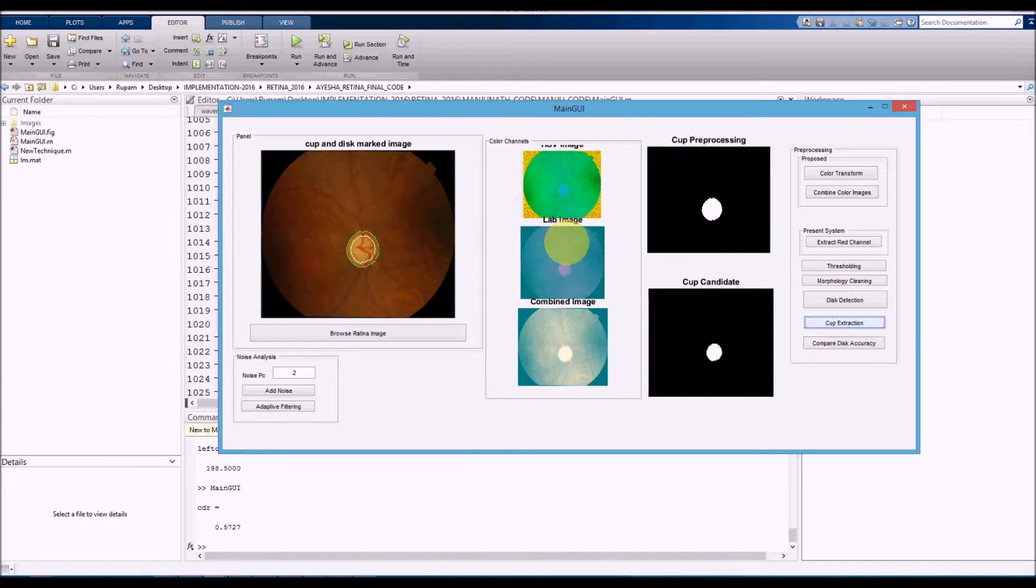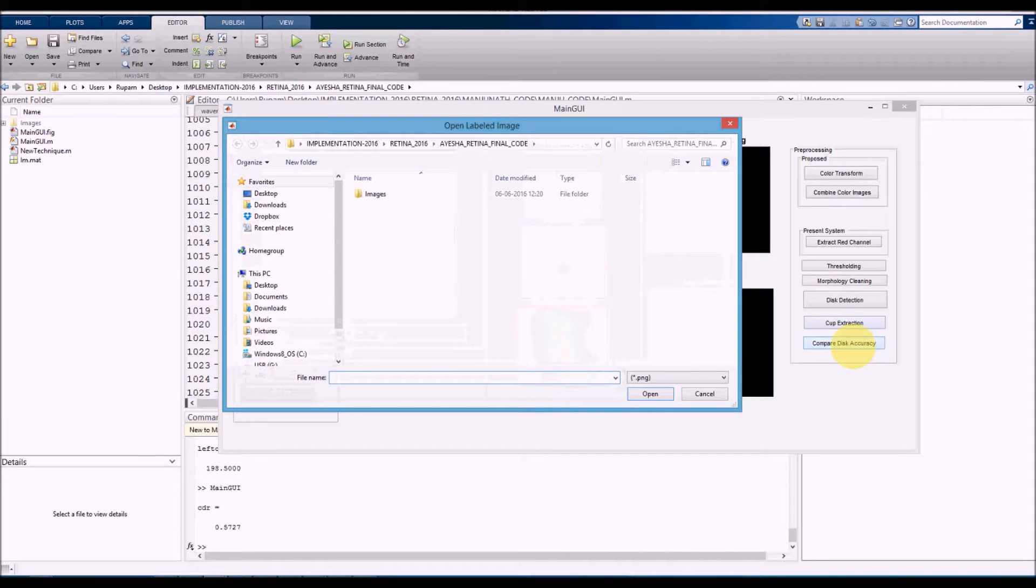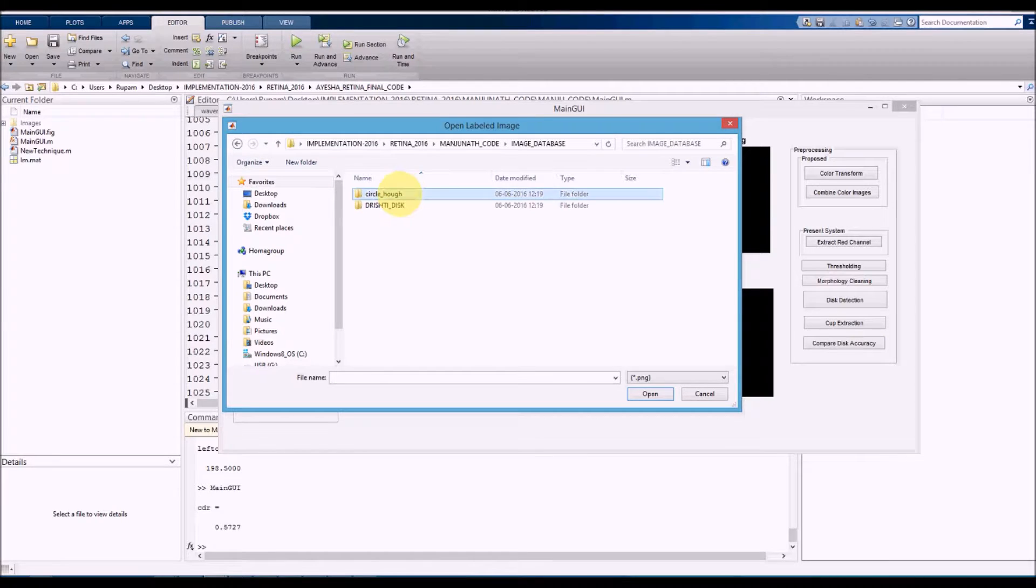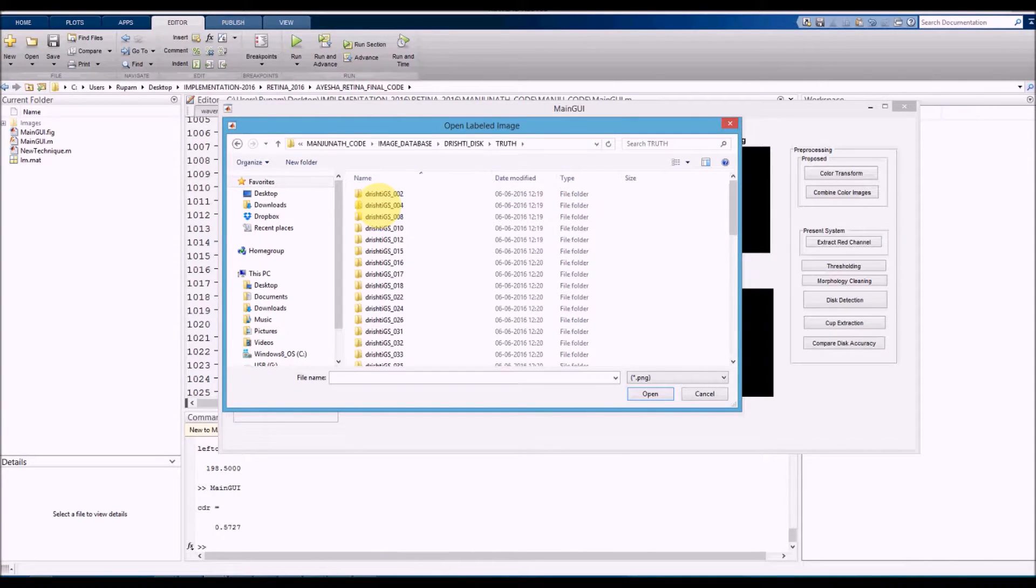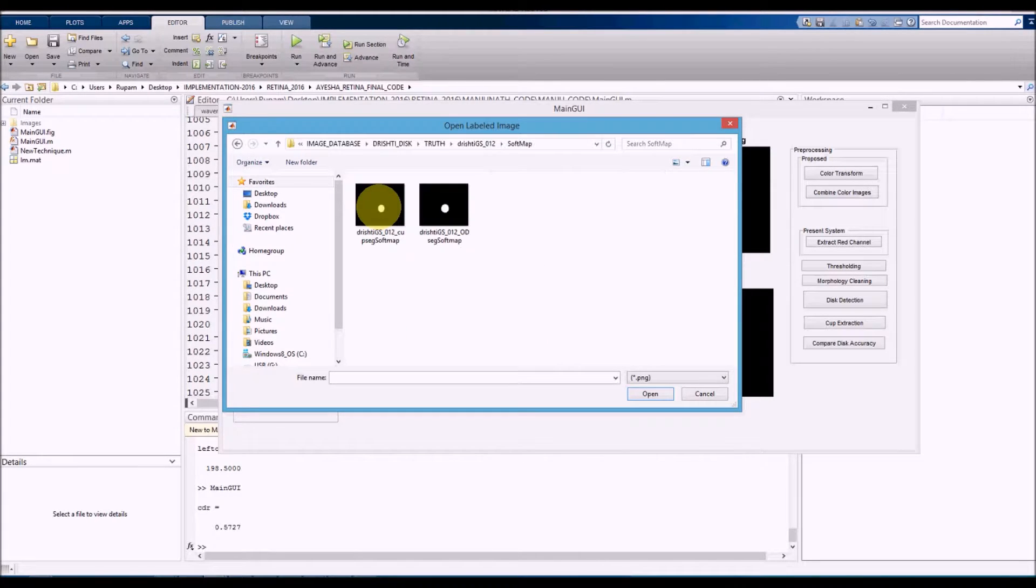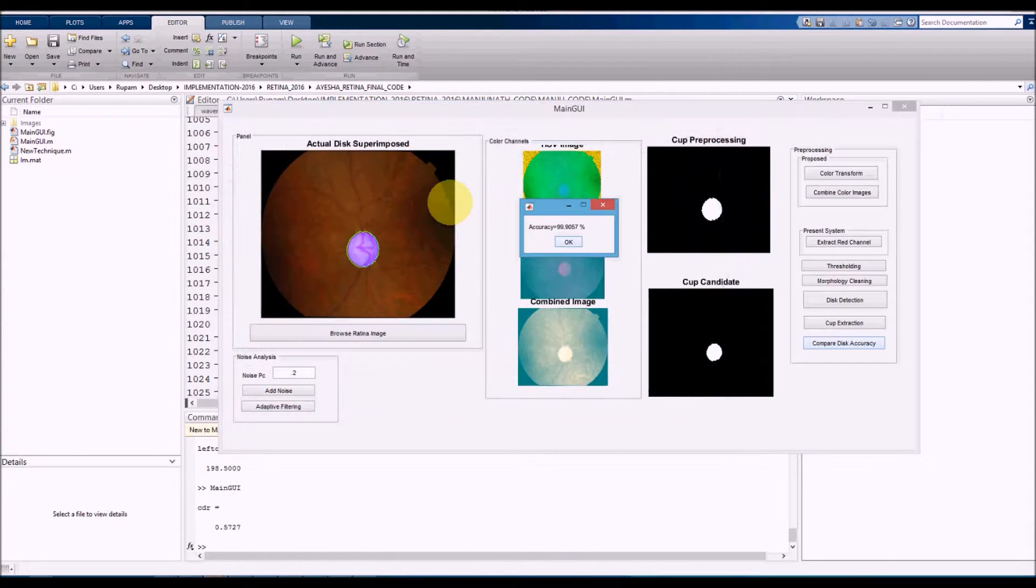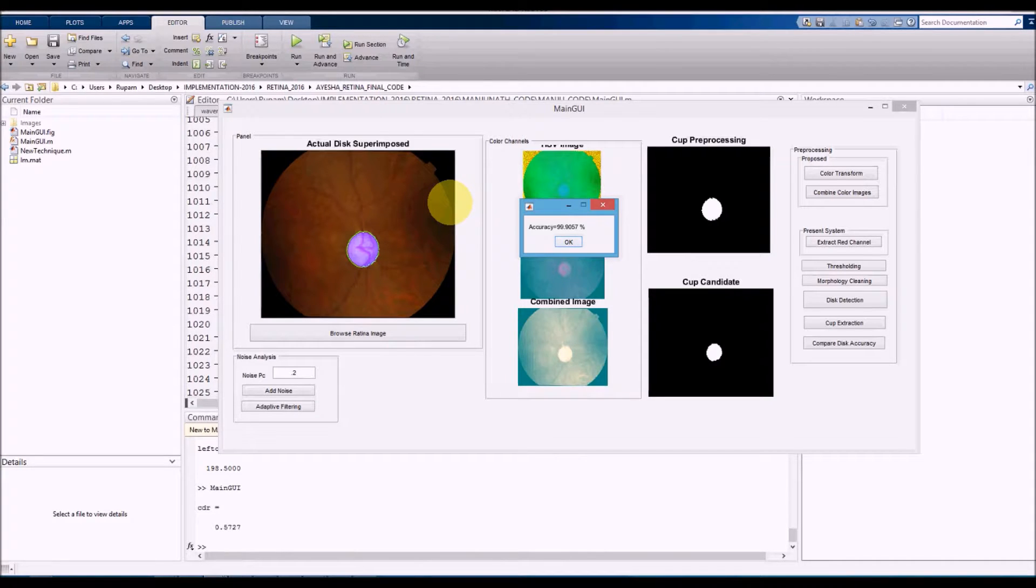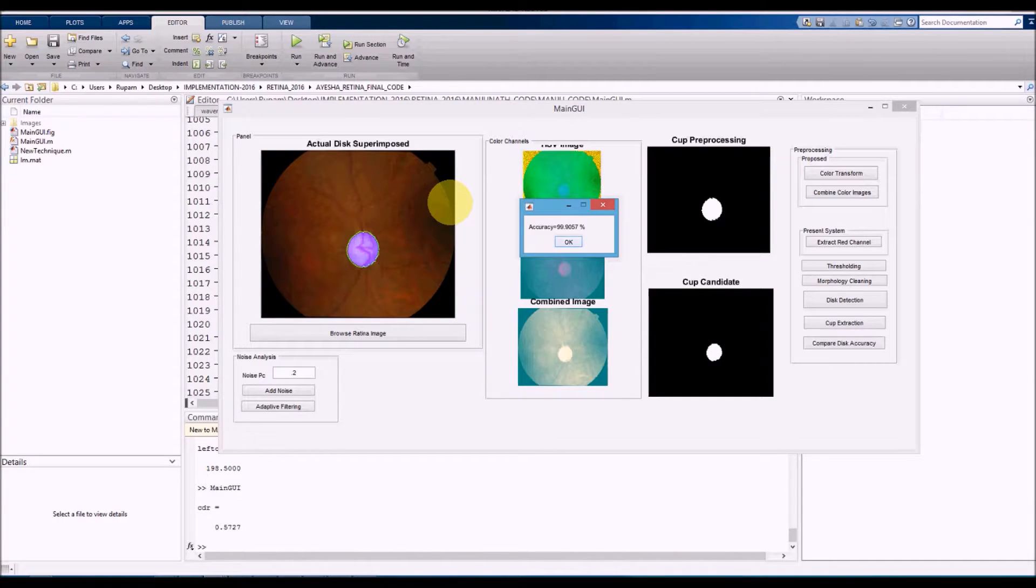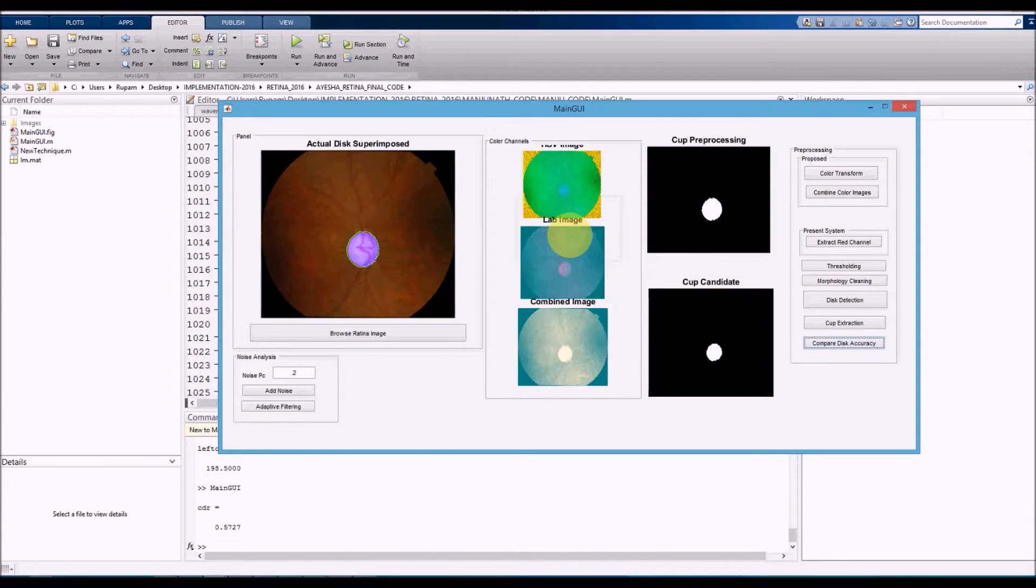Now we need to compare the accuracy. Click on accuracy. Image database, image number 12, soft map the disk area. This violet color is the area given by the doctor, and we get an accuracy of about 99.9057 percent. You can clearly see that the doctor's marked area and our marked area are closely matched.